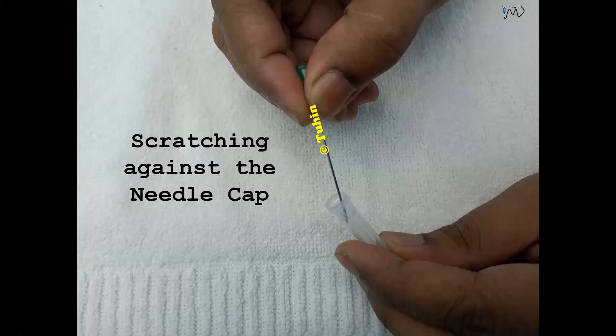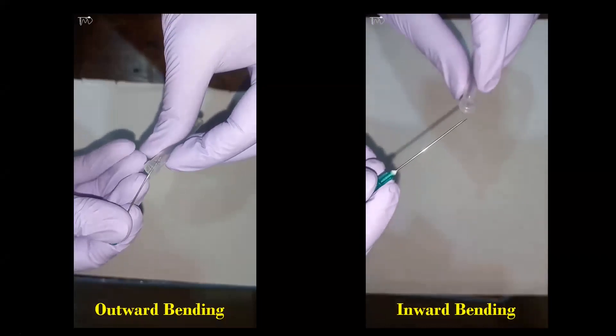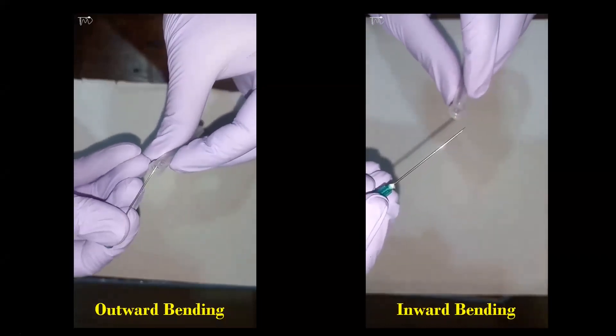This is what I do — just scratch the needle against the needle cap.